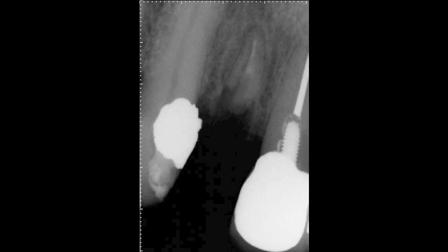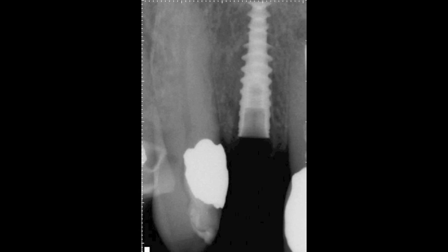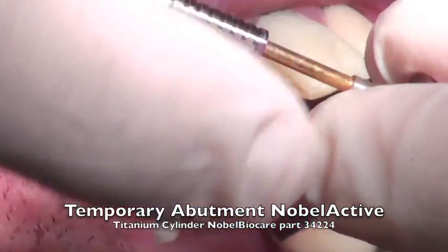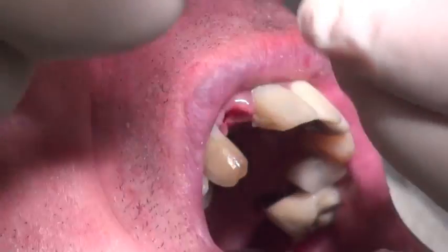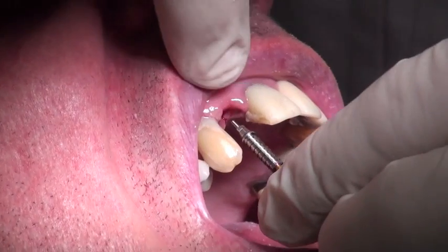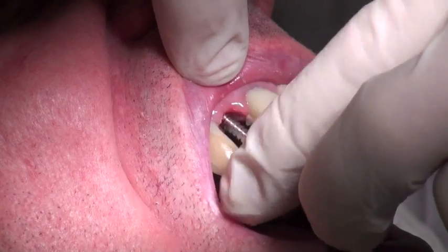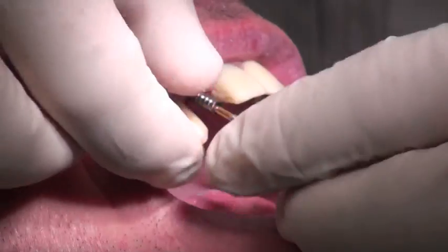The patient originally came with a broken-off tooth, so an implant was placed immediately in the lateral position. You can see the nice position of this particular implant. What we wanted to do was to preserve papilla and also to stop the patient from having to wear an immediate-type partial. The patient decided on this immediate placement of the temporary crown, so the temporary cylinder was actually placed on the tooth.